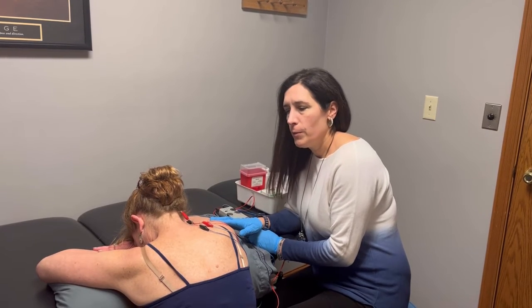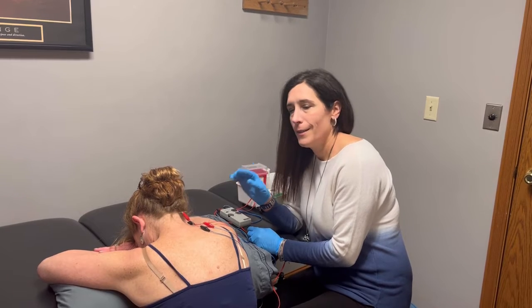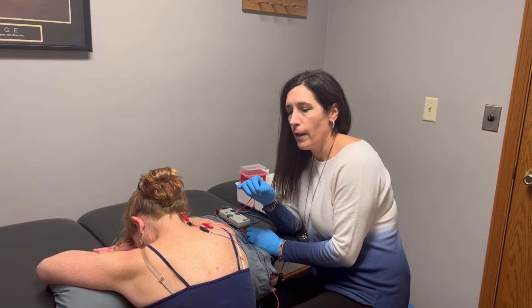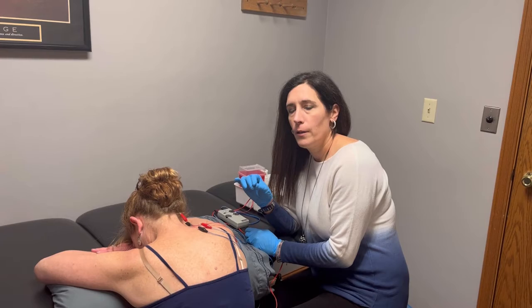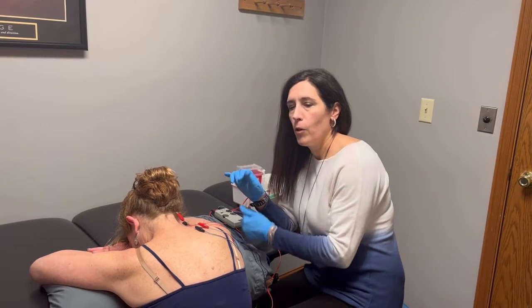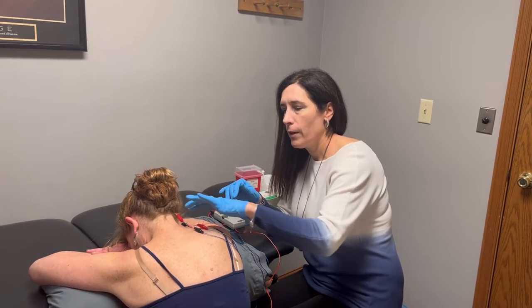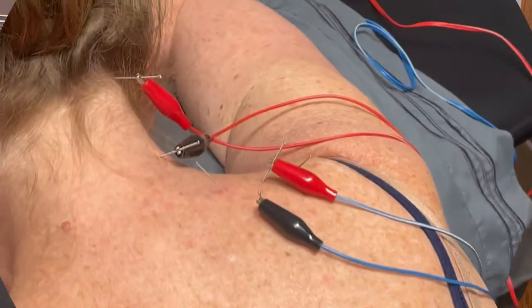So what we do is we take these needles, they're acupuncture needles, but this is not acupuncture. I just want to clarify that. Acupuncture is more of a Chinese medicine technique that follows meridians or pathways. Dry needling, we try to follow the nerve pathway.